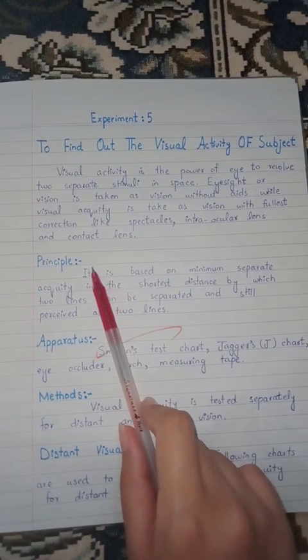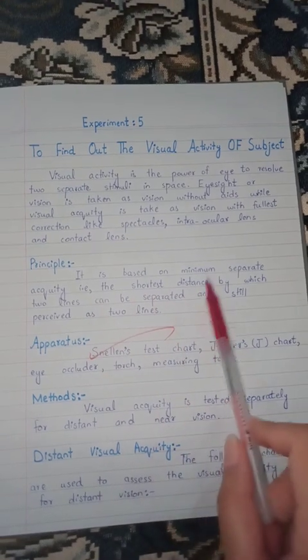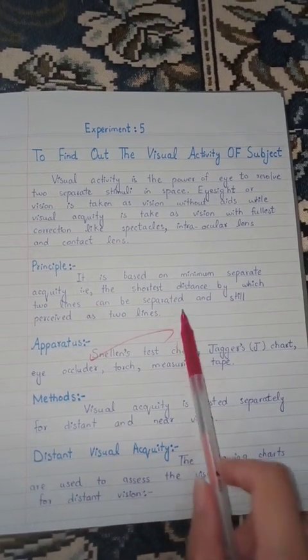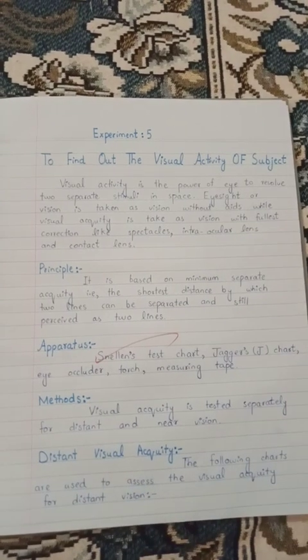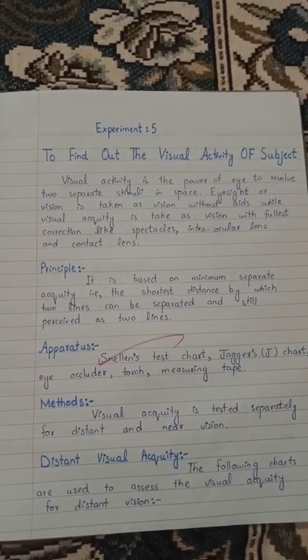Now we will discuss its principle. It is based on minimum separable acuity, that is the shortest distance by which two lines can be separated and still perceived as two lines. Apparatus: Snellen test chart, Jaeger's J chart, eye occluder, torch and measuring tape.